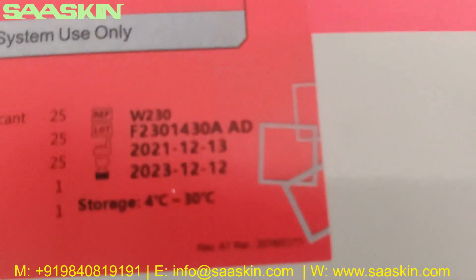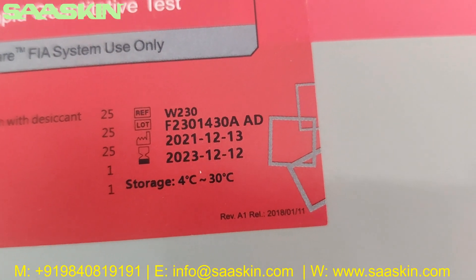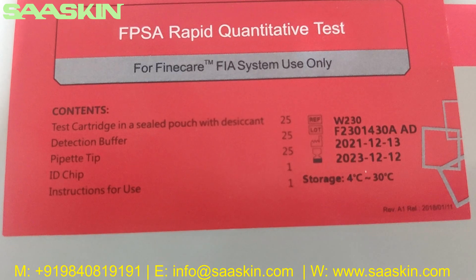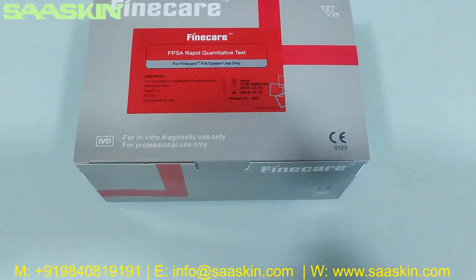You can see the reference part number, lot number, expiry period, and the storage temperature conditions. The contents include 25 test cartridges, 25 detection buffers, 25 pipette tips, 1 ID chip, and 1 instruction for use manual.